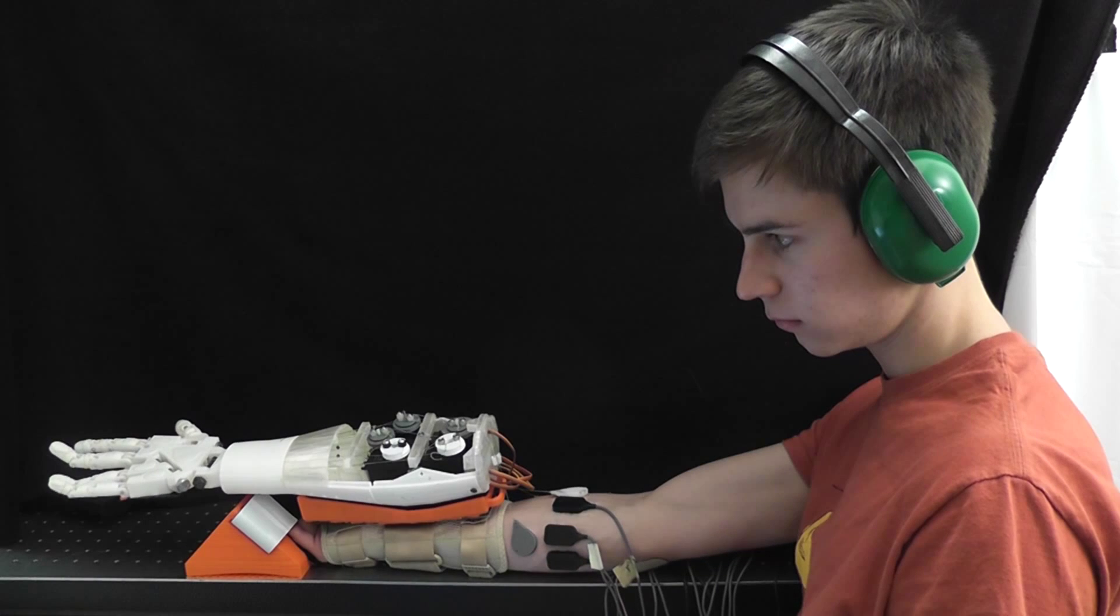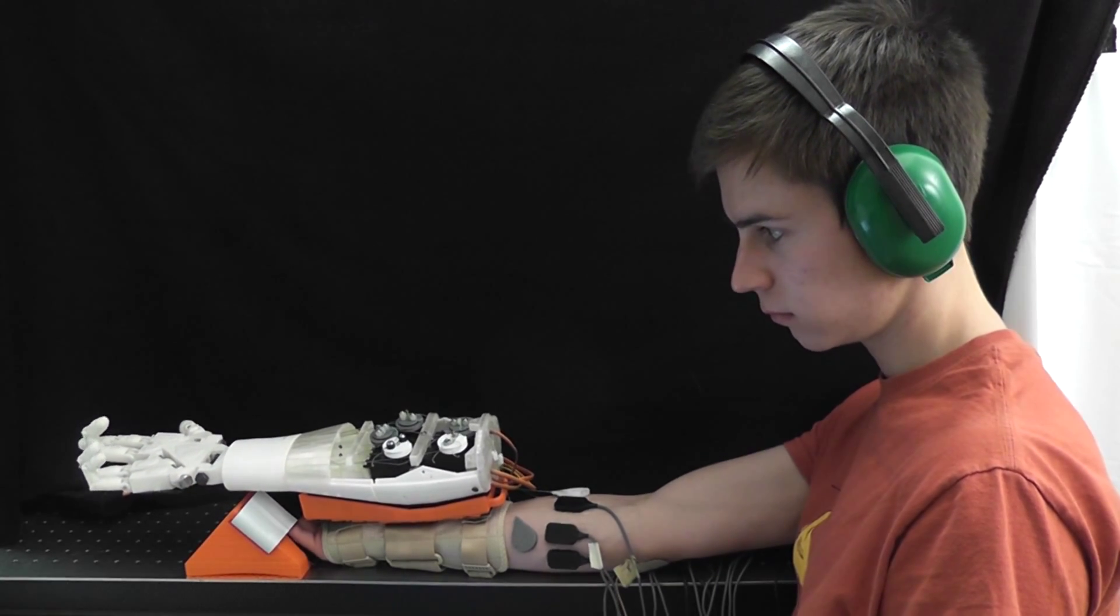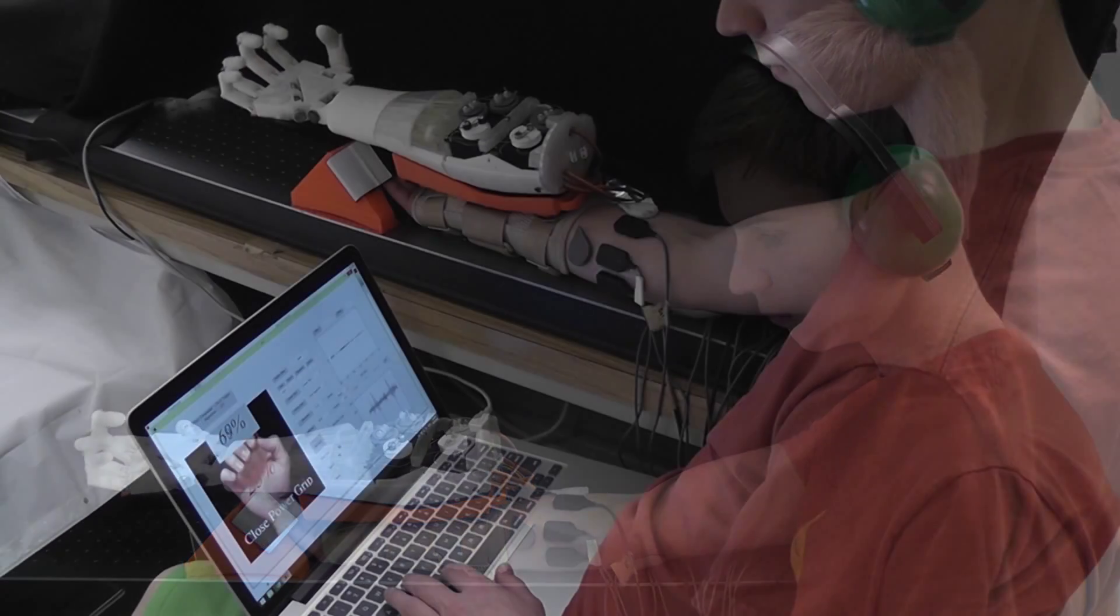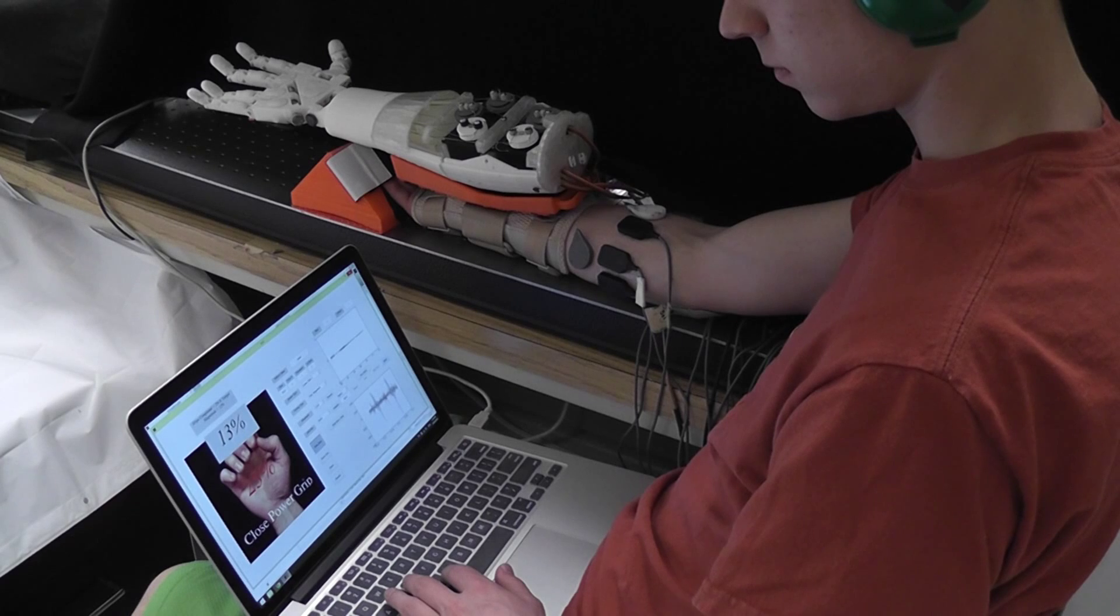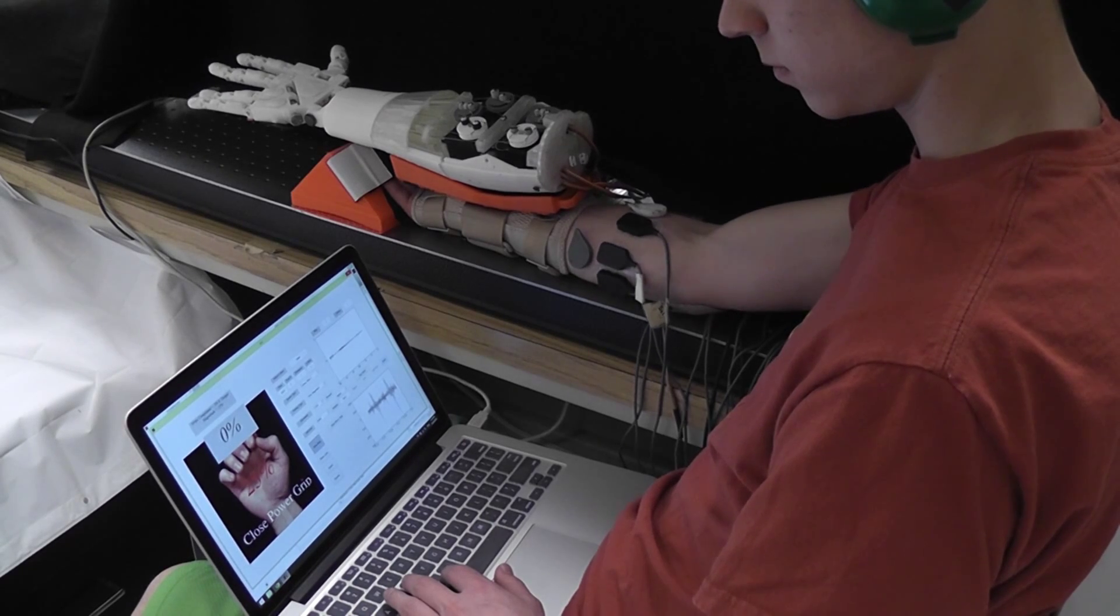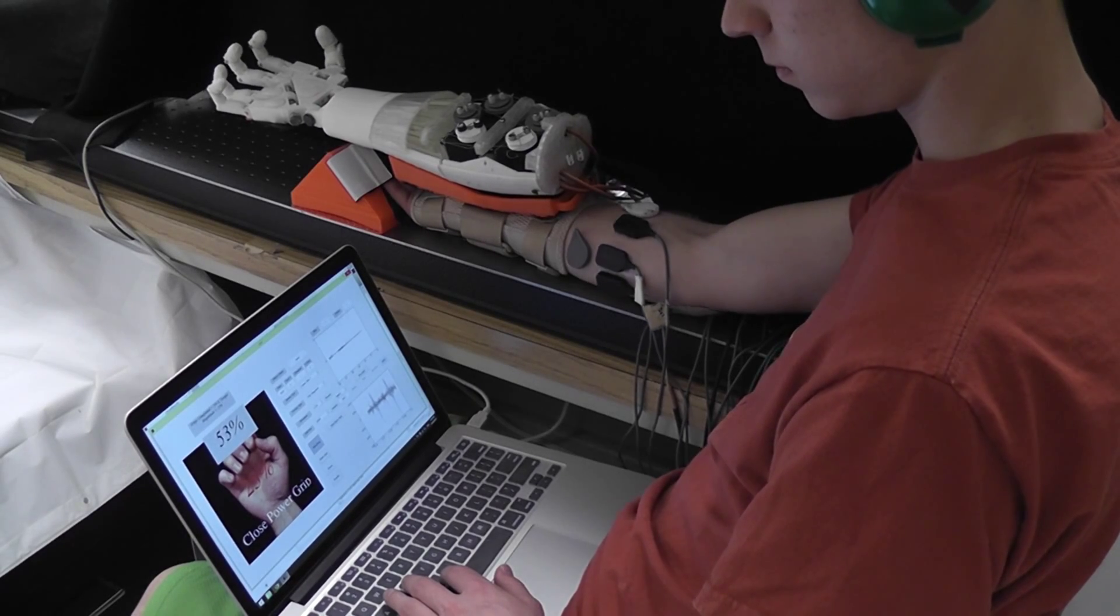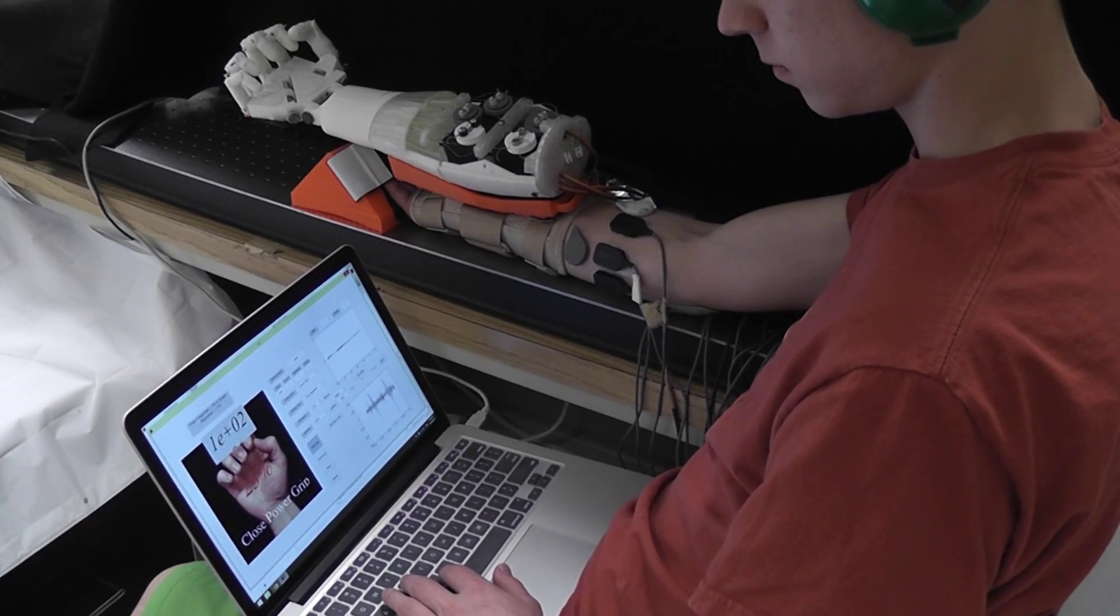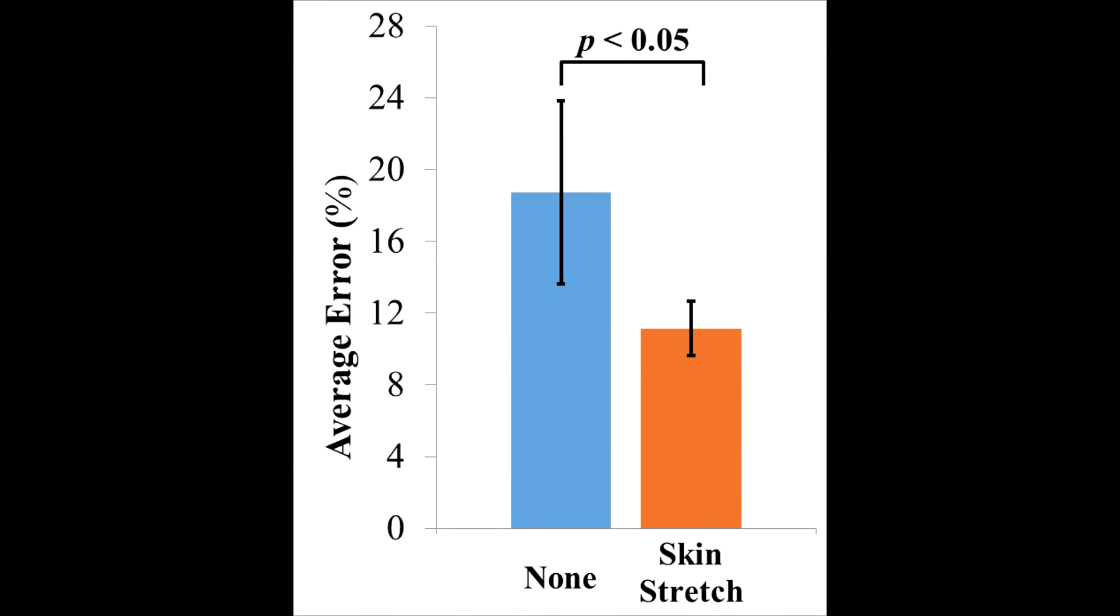In our final experiment, we asked subjects to match a particular grip aperture using EMG. Subjects were presented with either skin stretch feedback or no feedback at all. Here, you can see the subject controlling the aperture of a pre-selected grip to various percentages of closure. For 30 different combinations of the six grips and target apertures, the subjects matched the grip apertures with 11.1% error on average.